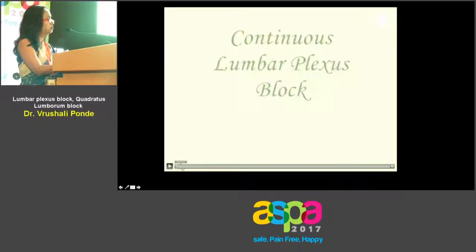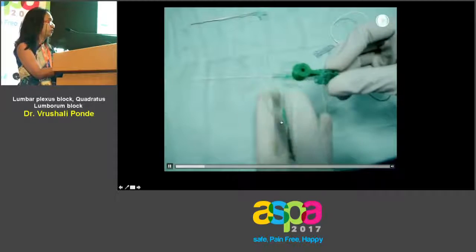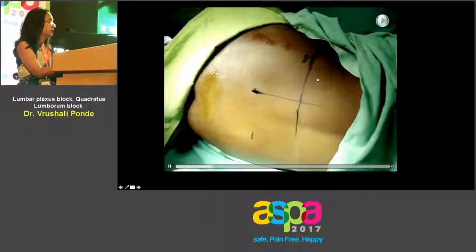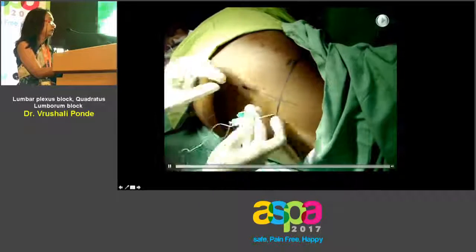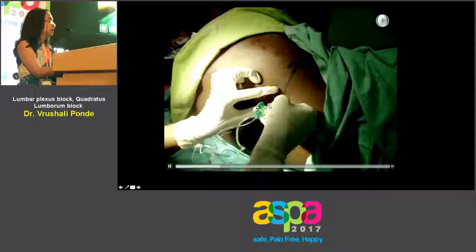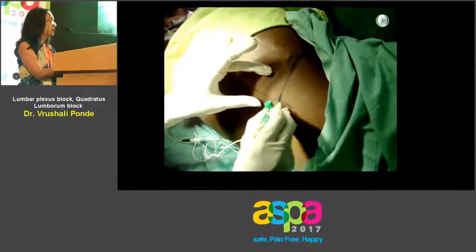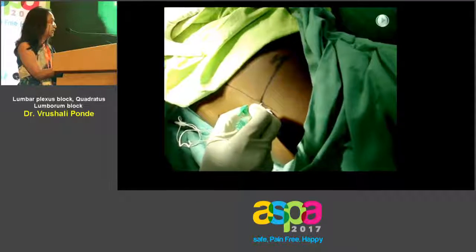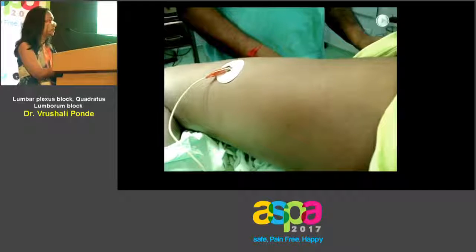Continuous blocks too help. This is the needle that we usually use, but it can be replaced by a cannula as well. This is just what our everyday practice has taught us. In this particular video, perhaps the trajectory might become even clearer. I'm hitting the bone right now, which is the transverse process, sneaking underneath it, and I'm manipulating the needle to get the desired response. This is an adolescent patient.